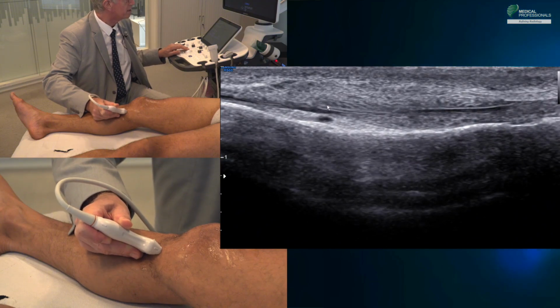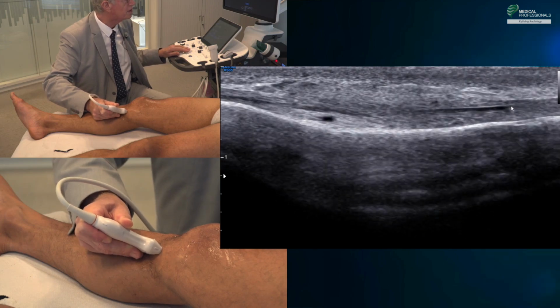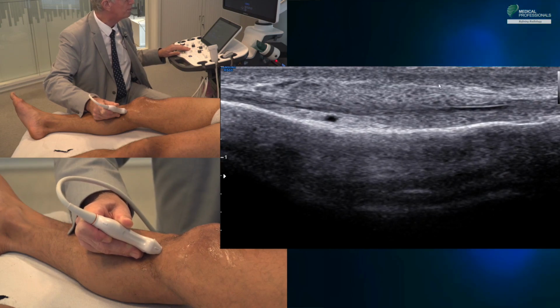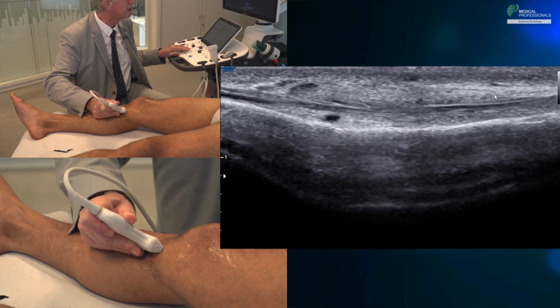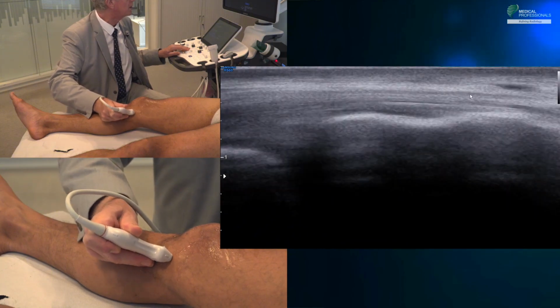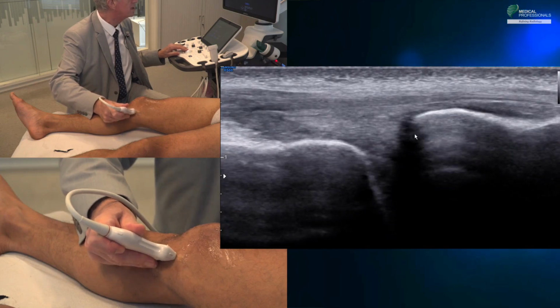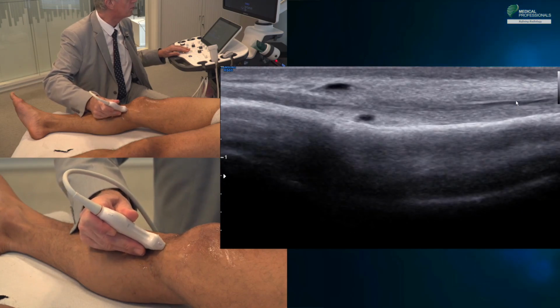These tendons of the pes anserinus are interesting to study, especially in the event of a distal sprain of the ligament. This is because it is necessary to be certain that the ligament did not come to position itself on the surface of the tendons, carrying out what one calls the Stener-like lesion at the knee. Here we looked at the medial collateral ligament in the axial plane and in the coronal plane, also the meniscus and the distal part of the ligament crossed by the tendons of the pes anserinus.